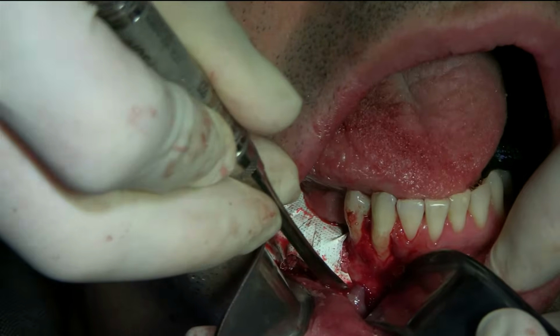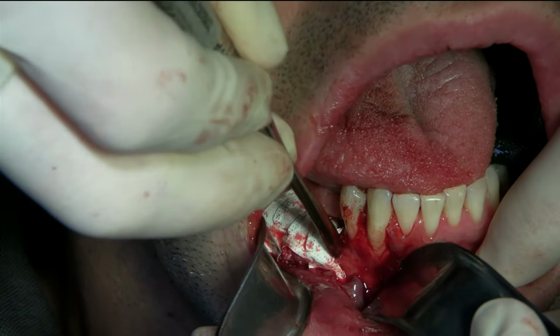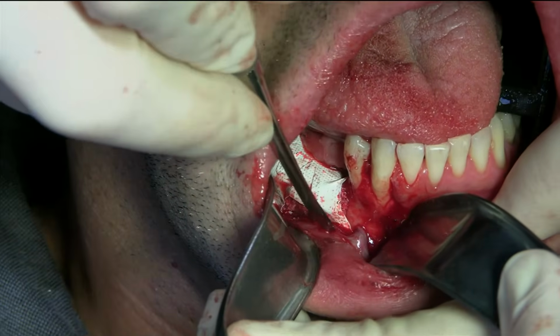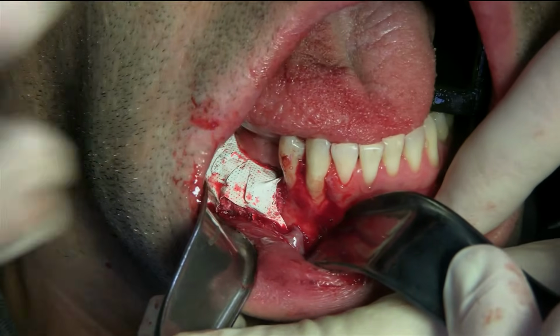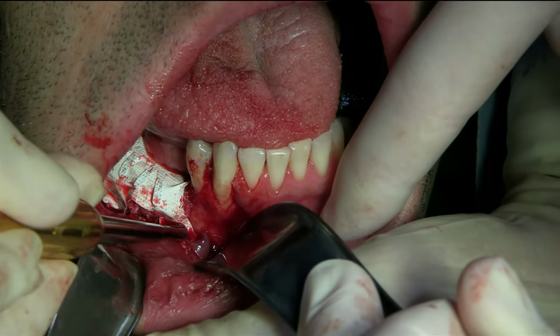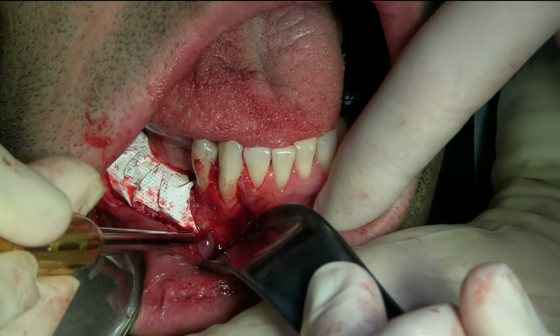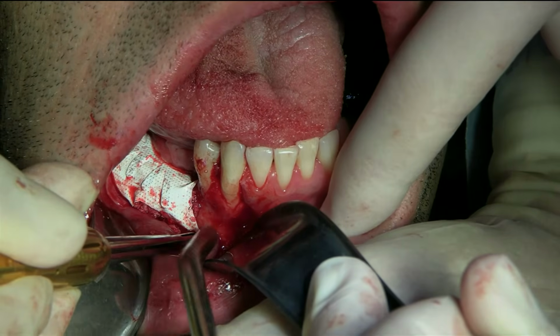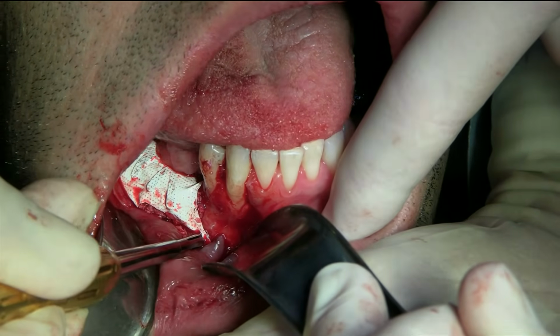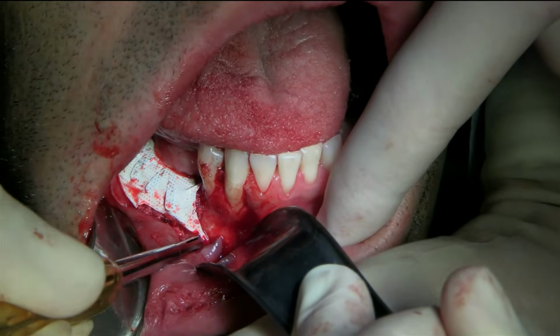We're going to have to use a collagen membrane. Okay, another pin. Can you suction just in this spot here, where I am? Yeah, perfect. Okay, how's that? A little bit open on the anterior, but we can do that with a membrane.